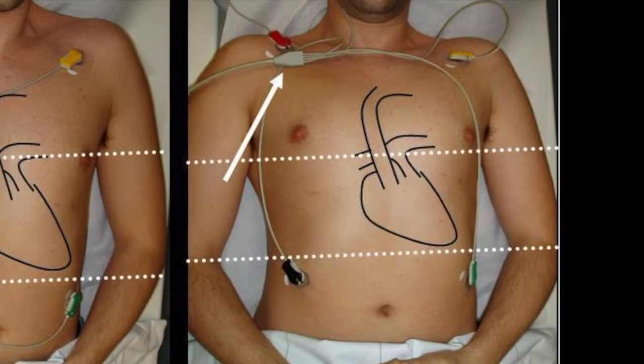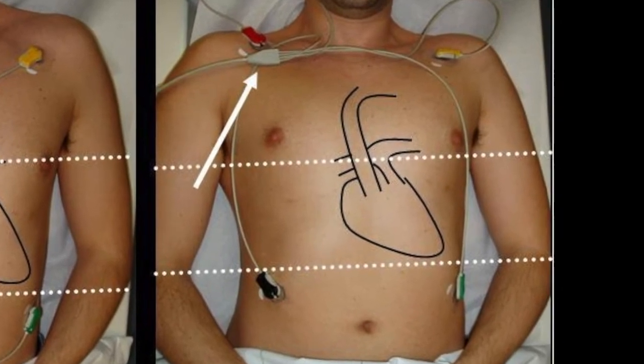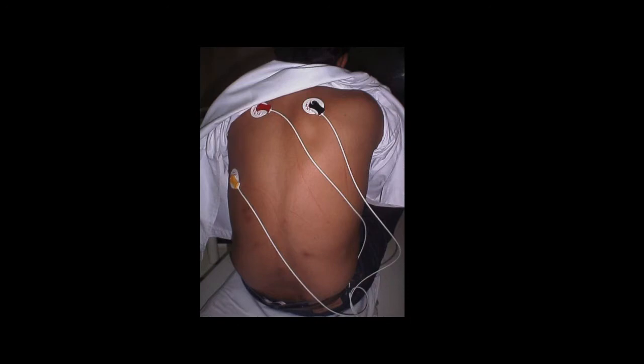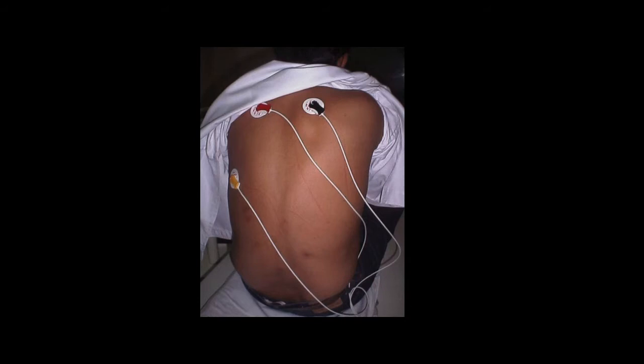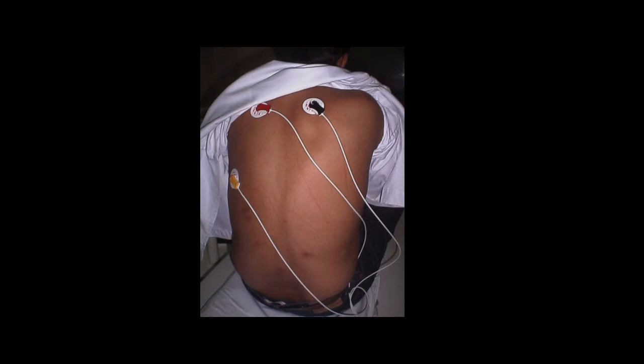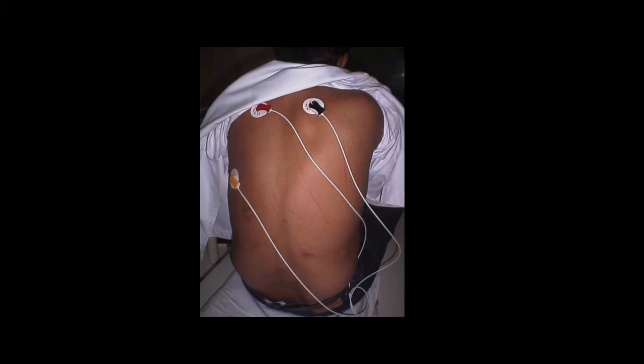Sometimes, in spite of doing everything correctly, we might still not get a good ECG trace. In that case, we can place the electrodes at the back. There is no particular order in which we need to place them, but we need to place one lead below and two on either side near the scapula.